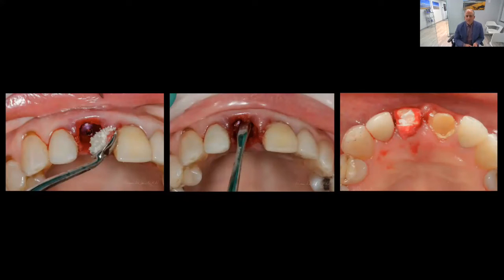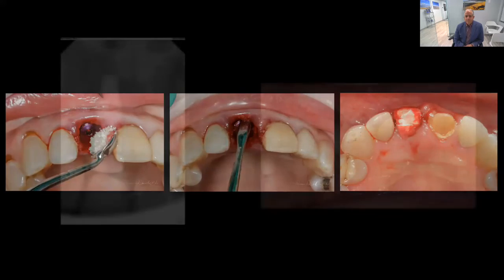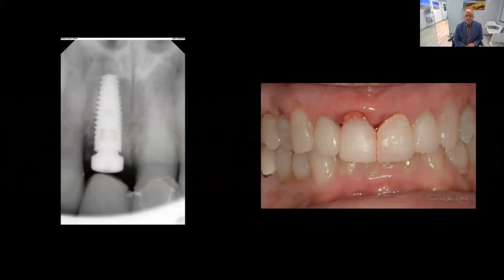and place that on the palatal with some type of either condenser, or in this case just a periosteal elevator, and then just condensing that apically. Because she'd already had a temporary crown on 9, I just created a cantilever temporary restoration, put a little bit of a collagen plug there, and just let her go with that temporary restoration. So here's what she looks like day of surgery, right after surgery, with that temporary in place, and you can just see that collagen plug there just kind of hanging out.